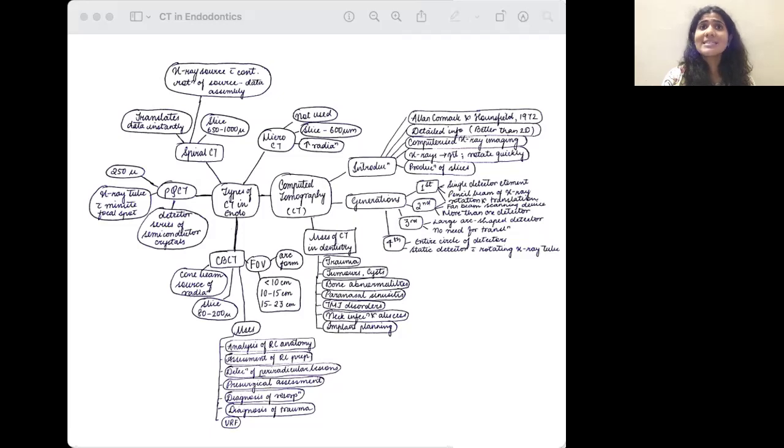For pre-surgical assessment in cases of pulp obliteration, where you need to think technically about how to go ahead with the case, either surgical or even routine endodontic treatment, CBCT comes into action. For diagnosing a resorption, the type, location, and extent of resorption, and to plan the management of such internal and external resorption, CBCT helps us. It also helps to diagnose trauma. If there are multiple traumas across multiple planes of the maxillofacial region, then definitely CBCT comes into play. In this, a larger FOV CBCT can be taken.